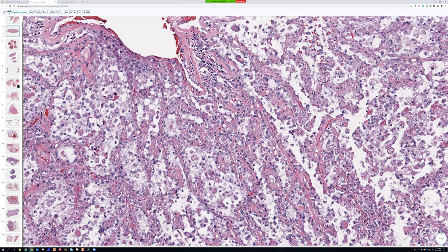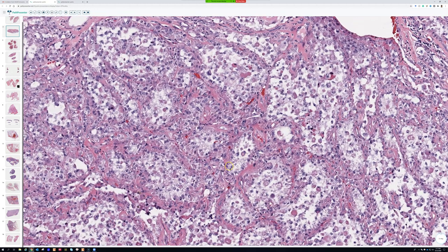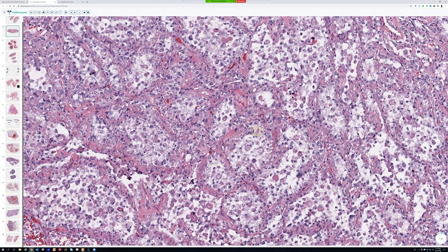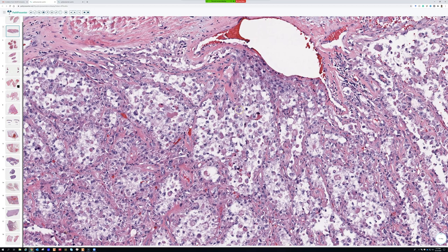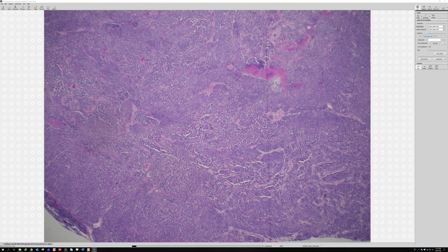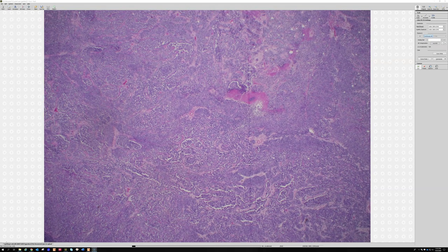Even though many people think of ASPS and alveolar rhabdomyosarcoma together in the same differential, I feel they usually look quite different. If all the cells are pink, clear, or pale-looking large plump cells with big nuclei and there are no round blue cells, it's probably alveolar soft part sarcoma — not alveolar rhabdomyosarcoma. I added this comparison after the lecture so you can see the contrast between the two tumors.